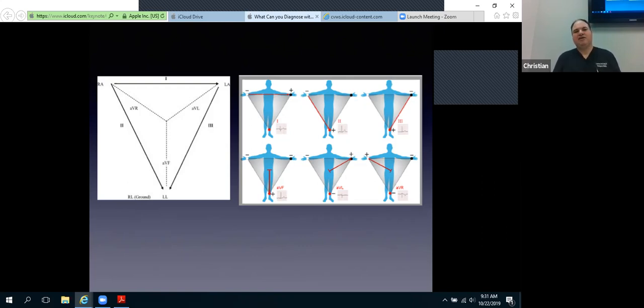In fact, I've done this experiment myself, but there's literature on this as well, that if you put the limb leads even on the upper shoulder, it misdiagnoses the frequency of inferior STEMIs considerably by up to 20%. And so you need to put them just south of the shoulder. They don't have to go on the wrist, but they just need to go south of the shoulder joint.